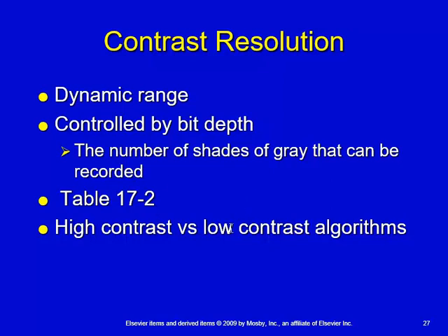So going back to our H&D curve, again, we're looking at page 299, and we went through this in chapter 10, I think it was. What we see there with that 400 image receptor speed is a very vertical H&D curve, which means a high contrast curve. A horizontal H&D curve represents a low contrast curve.